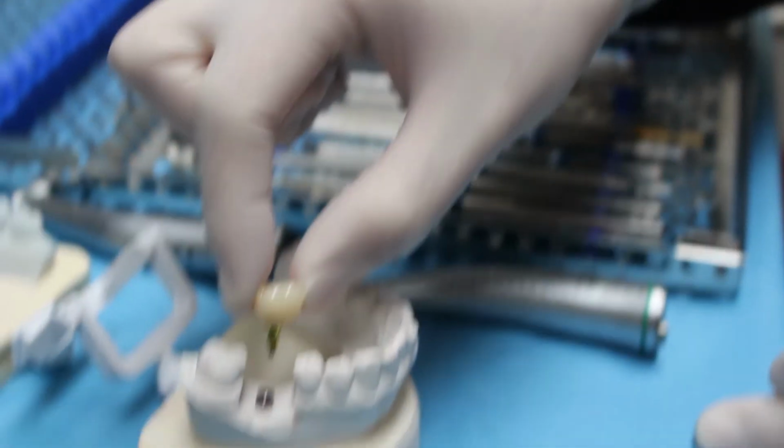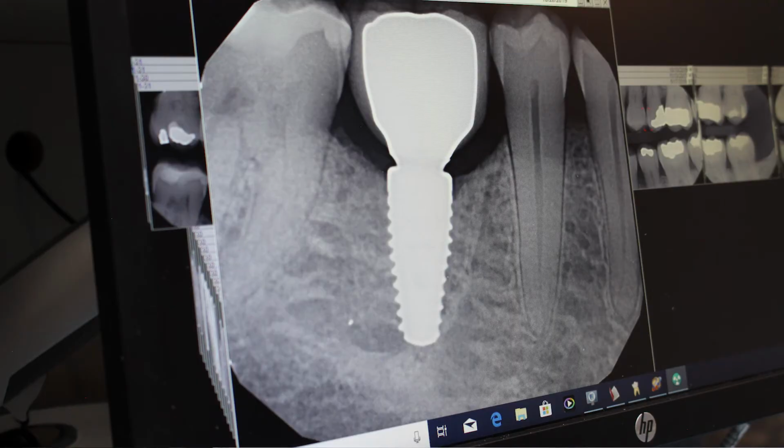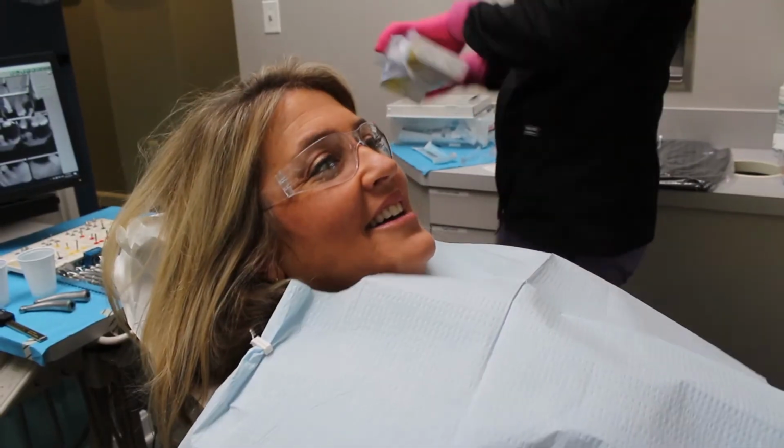And then, as the bone grows around that dental implant, after a period of about 3 months, we can go ahead and we place a crown on top of that dental implant. And just like Mother Nature had intended, we now have a fully functioning tooth.